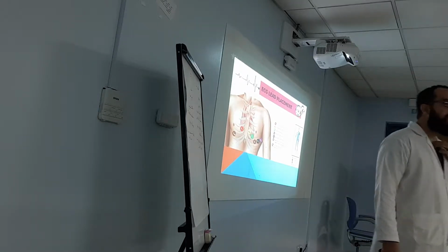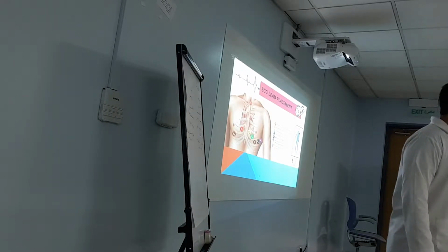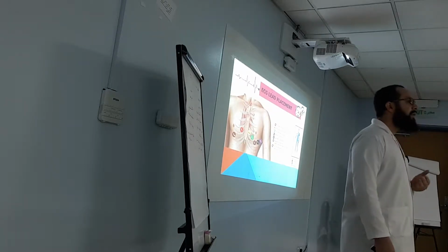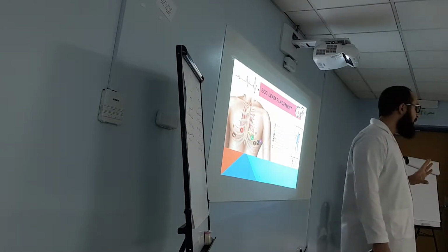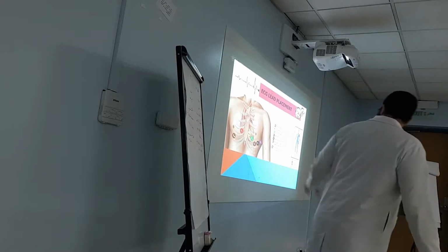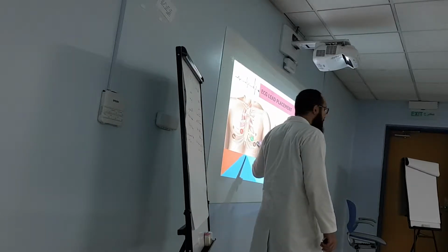There is a bony prominence here, starting from here to the shoulder. Divide this in the middle. This is your mid-clavicular line. Intersecting with the 5th intercostal space, this is where you put lead 4. Now why do I jump to lead 4? Because easily you can put lead 3 between lead 2 and lead 4, in the middle.